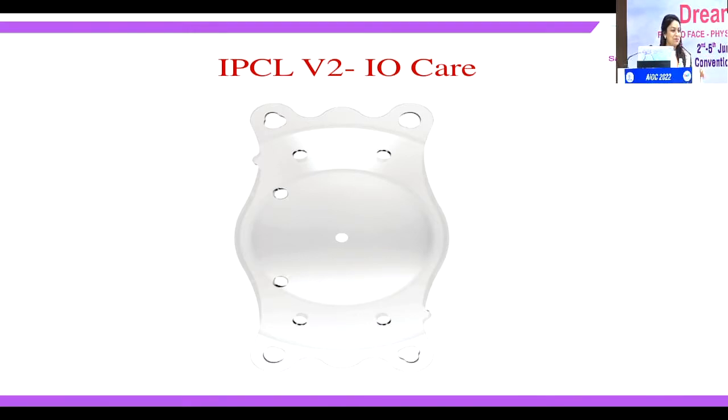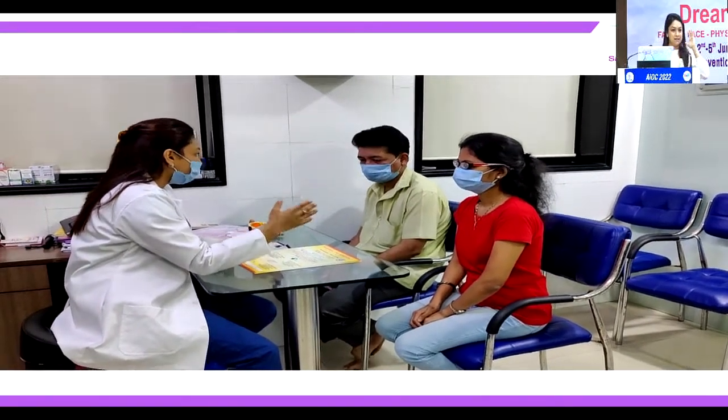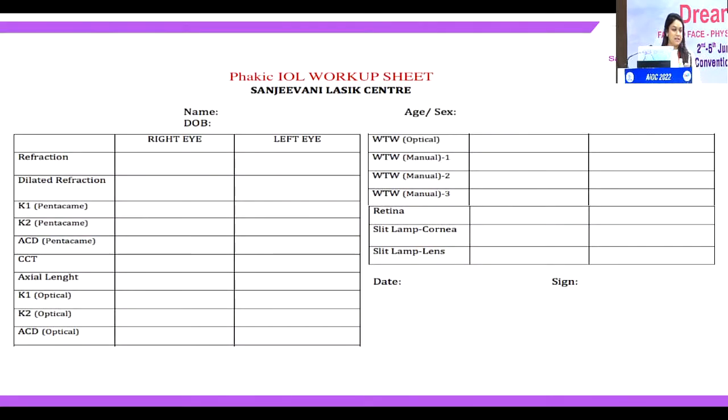So for me, it was a challenge to do an IPCL. This is just an illustration, because back then in 2016, we didn't know that a mask has to be used even outside the operation theater. Like any of us, the first case, we are going to do over-counseling. So I counseled the patient about all the risk factors, everything which was involved, what I expected out of her, what she needs to expect out of the lens. And then she decided to move ahead.